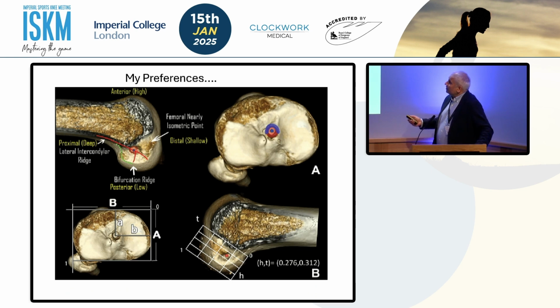And really, these are my preferences, if you like. I like to be 2 millimeters from the posterior edge of the femoral condyle, the over-the-top position, okay? And I'll show you in a second how I achieve this in a consistent manner. And on the tibial side, it's slightly medial and in the middle of the footprint. So don't shave away the footprint. Try and get some sense of where you're going to be placing the tibial tunnel before you mow the lawn, so to speak, okay? So be very, very meticulous and thorough in the way you do this operation.